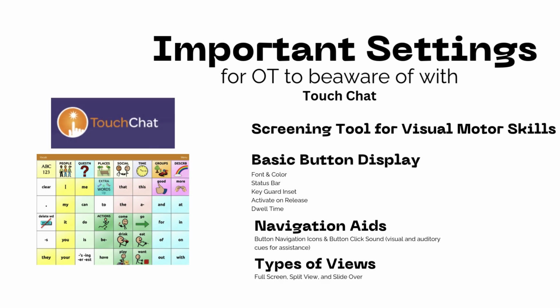Next, we'll be discussing important settings and features that OTs should be aware of with the TouchChat programs. First being the screening tool for visual motor skills, second, basic button displays, navigation aids, and lastly, the types of views that you can use on the device.